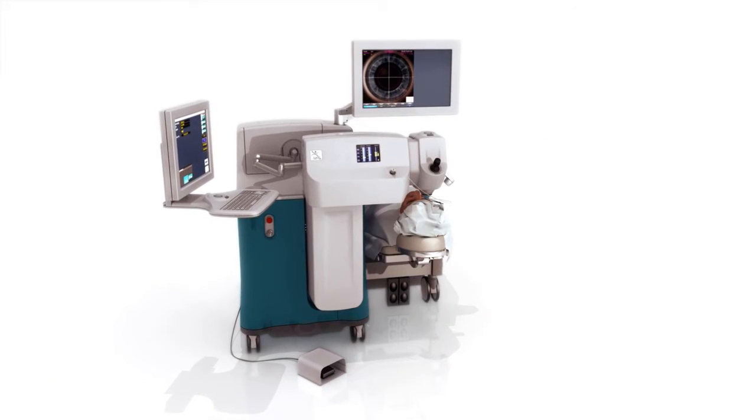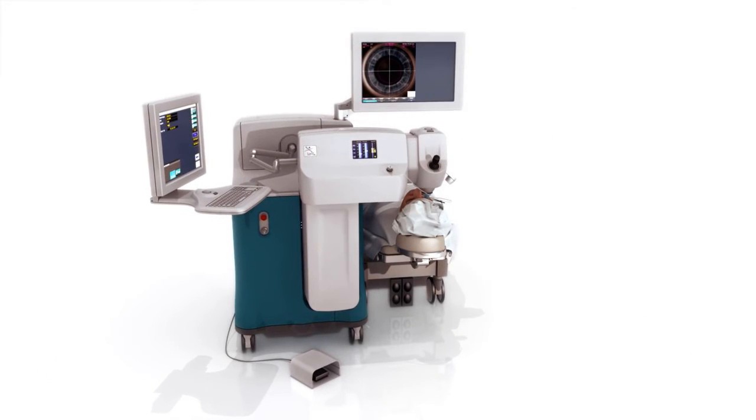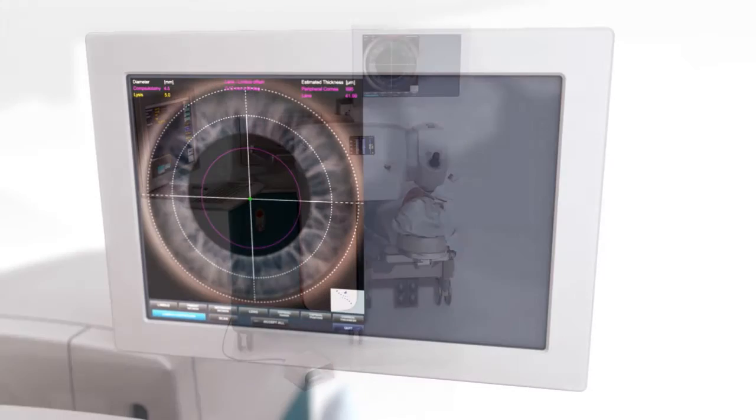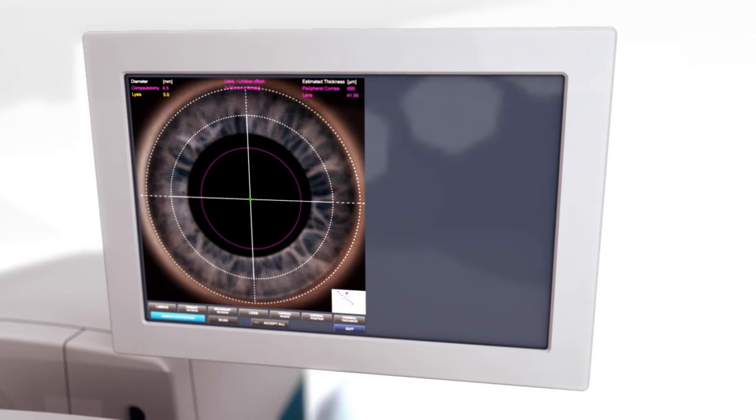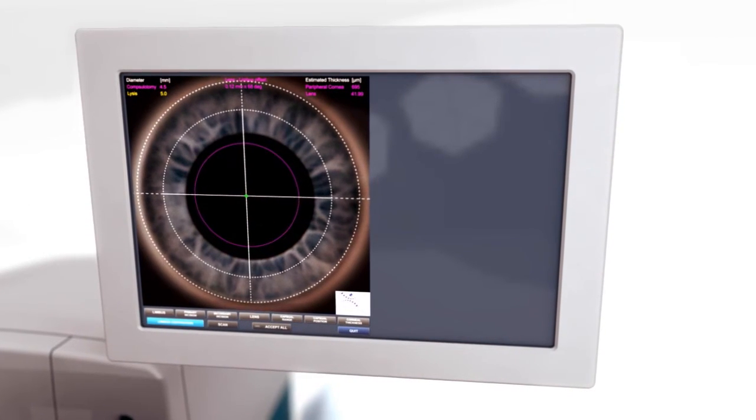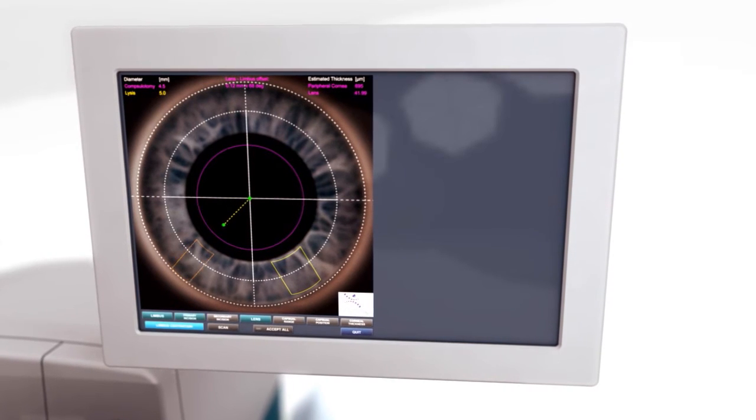The LensX laser brings a new level of customization to cataract surgery, allowing each procedure to be specifically tailored to patient anatomy and surgeon preference.